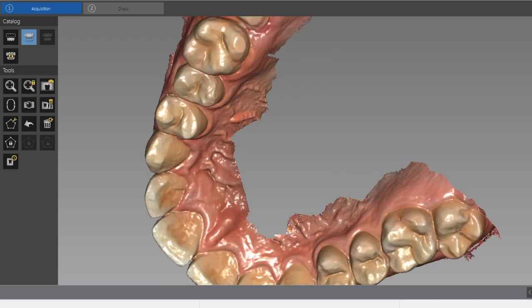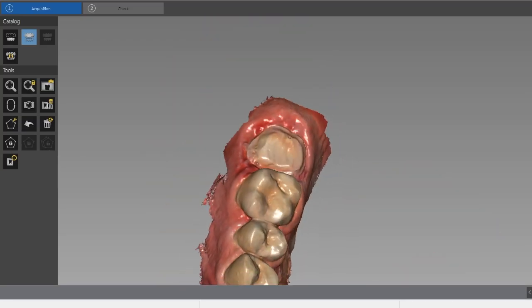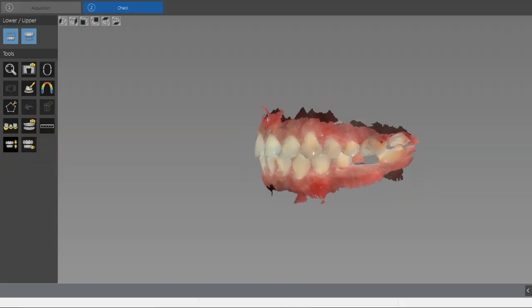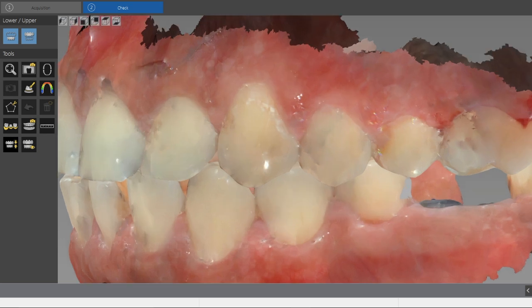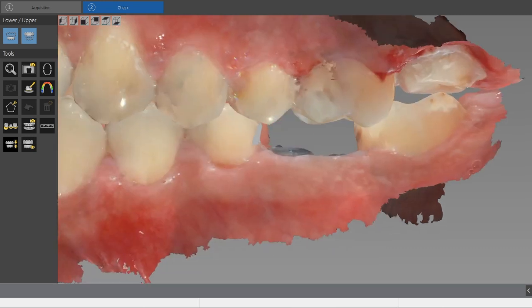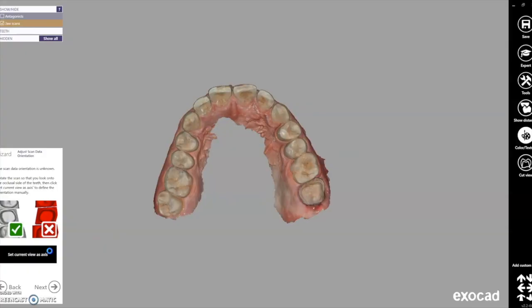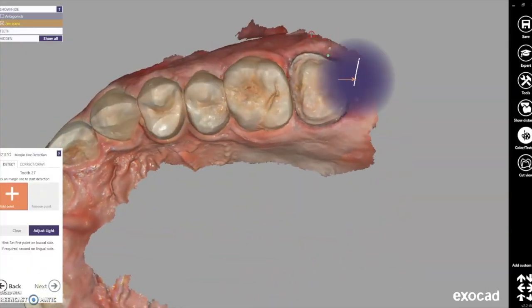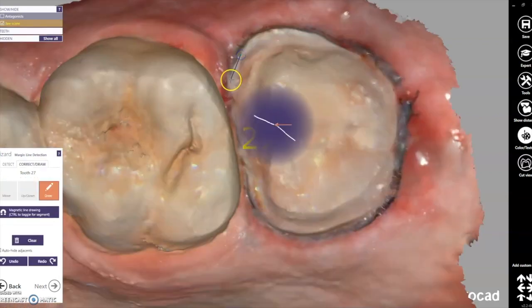Once the preparation is done, we then take digital measurements. This digital measurement is basically a 3D scan of your tooth, and this information is then sent to the lab by email, where the lab then downloads it onto their designing software and goes ahead with the actual process of preparing the crown.